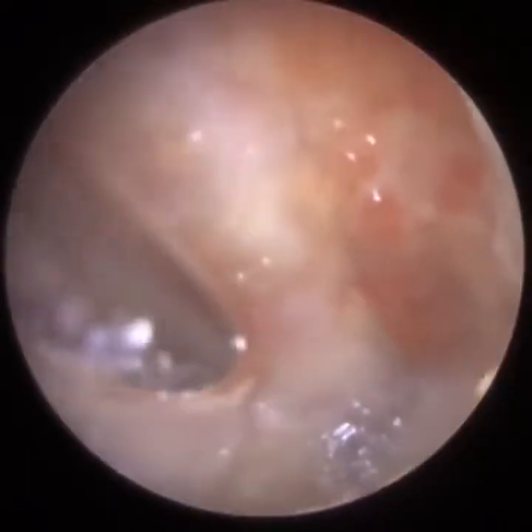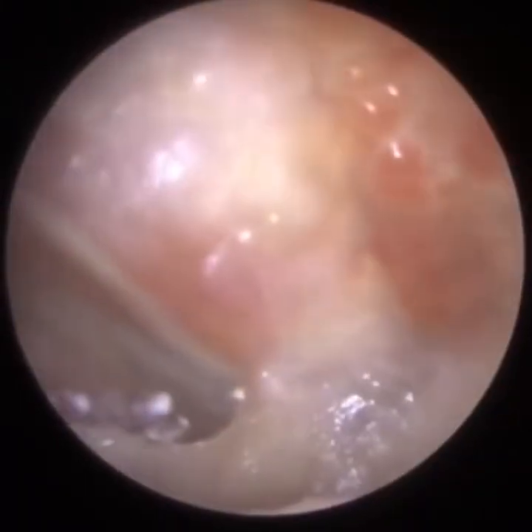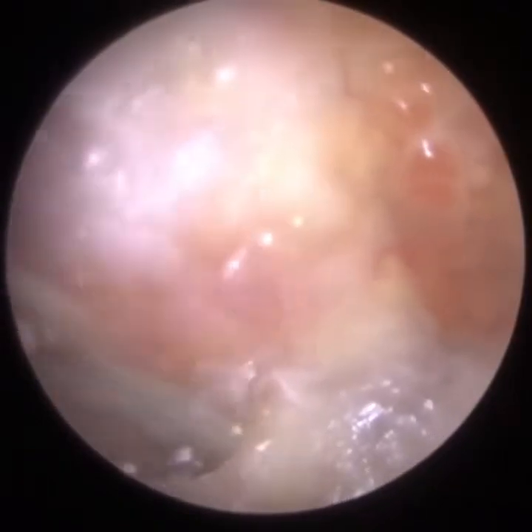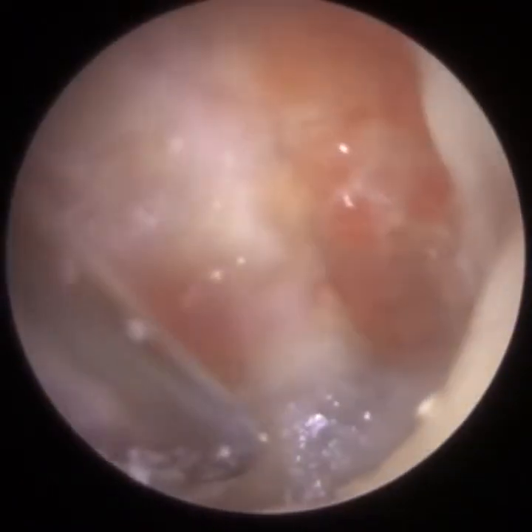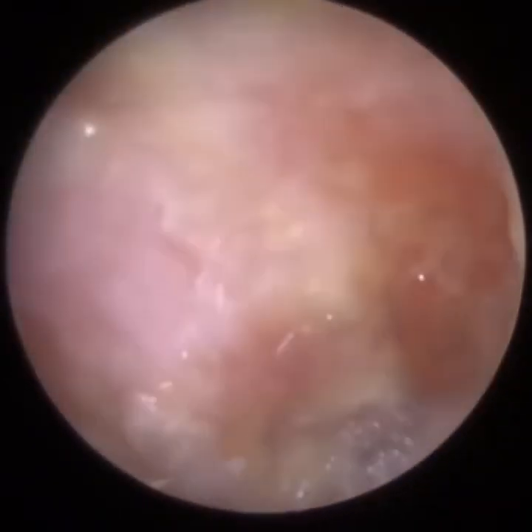Now, all the work I'm doing now, it's more preventative. I'm just trying to delay and extend the time period whereby the patient would need to return. What I'm doing now is not necessarily going to improve the patient's hearing. The patient can hear as well as they are going to be able to hear. I've removed the blockage, the sound can travel through, it can hit the eardrum. But this skin is not going to migrate. It hasn't for years, because it's chronic.